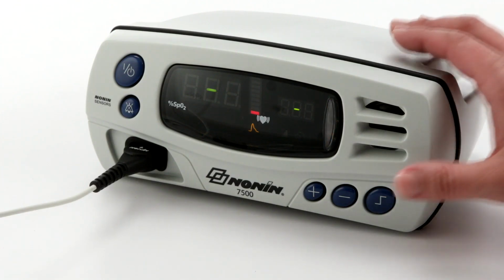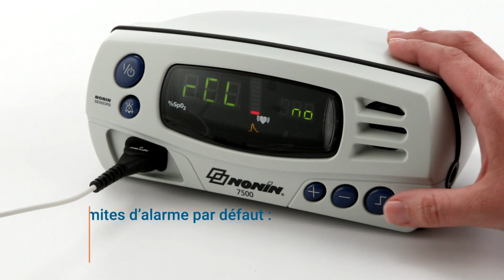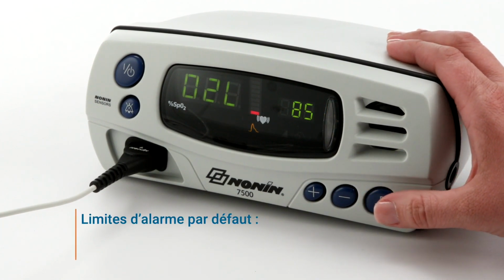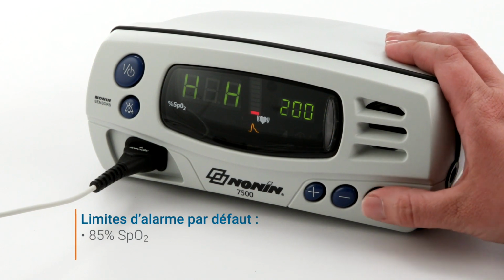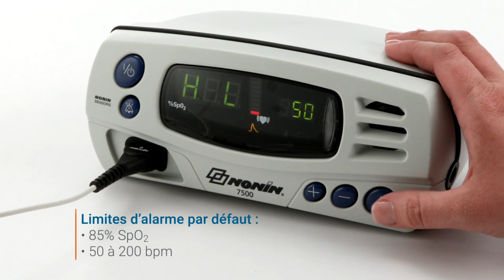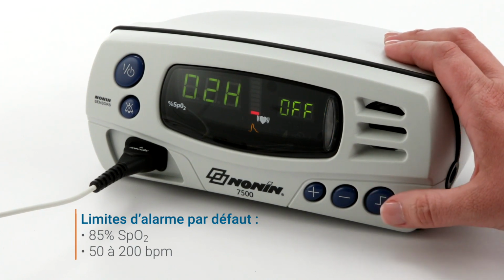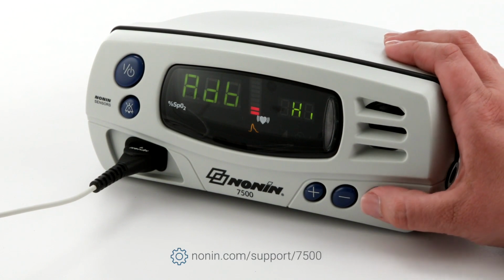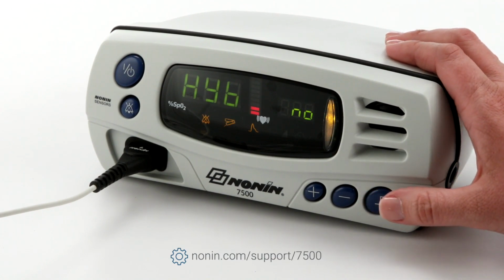It's recommended to set and check alarm limits and other oximeter settings prior to each patient use. The oximeter comes with a default low alarm setting of 85% SpO2, a low pulse rate of 50 beats per minute, and a high pulse rate of 200 beats per minute. These may be customized in the setup mode explained in the operator's manual.